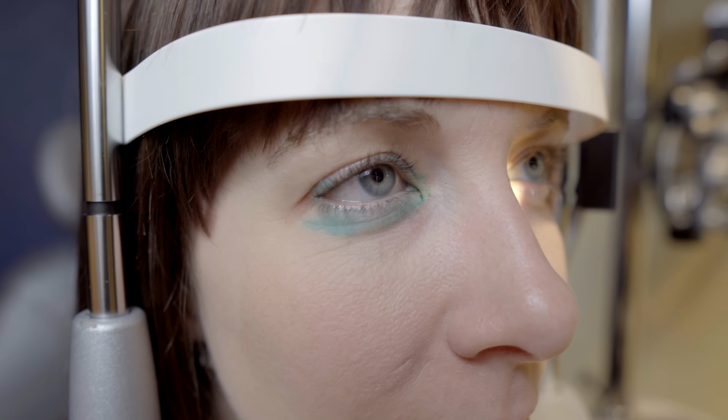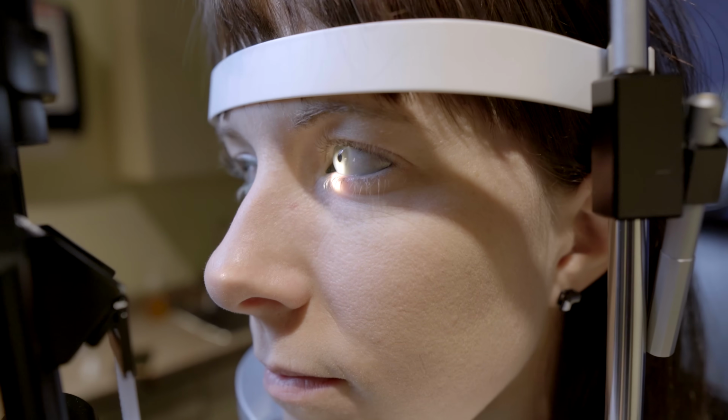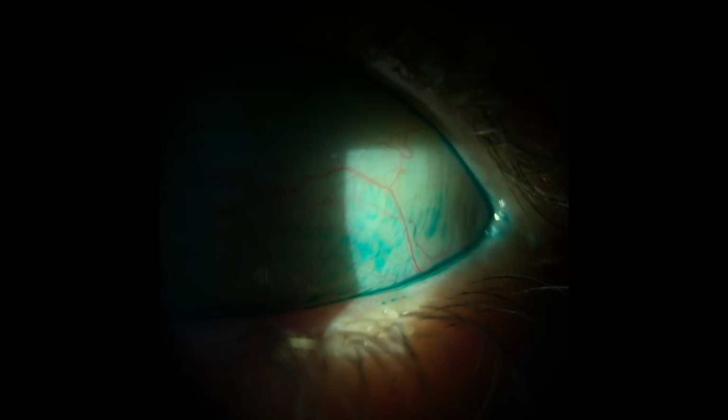But Lissamine green is a dye that stains devitalized cells, or surface cells that have lost their glycocalyx or their mucin layer, which I find is very good for staining the conjunctiva, the outer clear coating on the white part of the eye. Because for some people, the cornea may look great, they're not having any surface damage there, but in fact, the damage is all on their conjunctiva, and you can see they have no mucus layer, and they're just having extreme staining there. So dry eye is really not just about the cornea, it's about the whole eye. Your doctor has to be looking at everything.